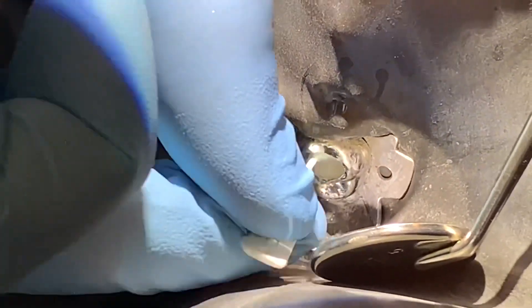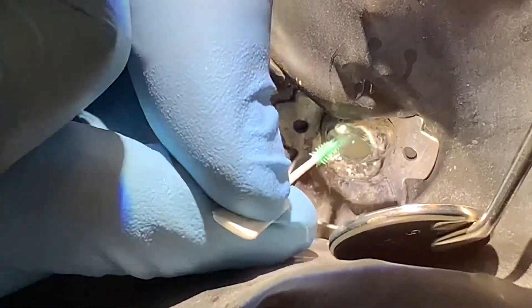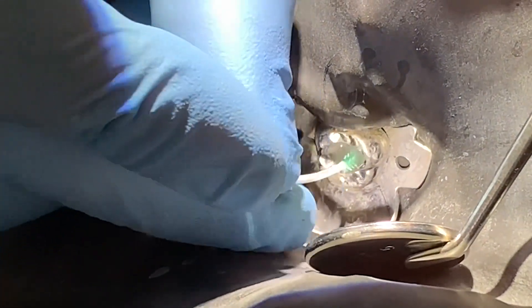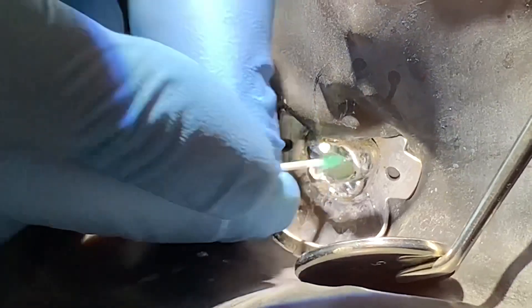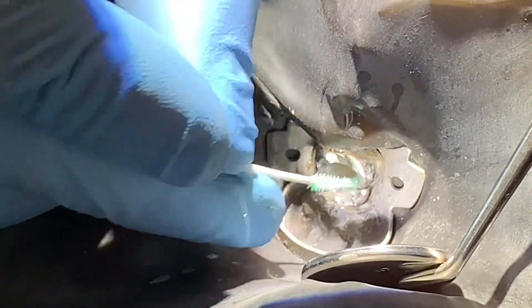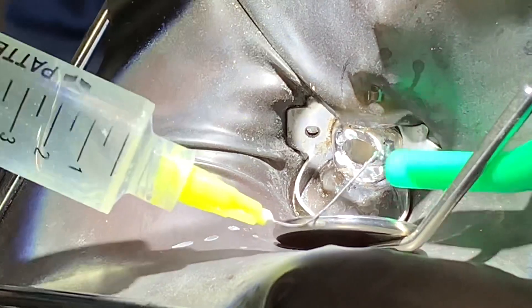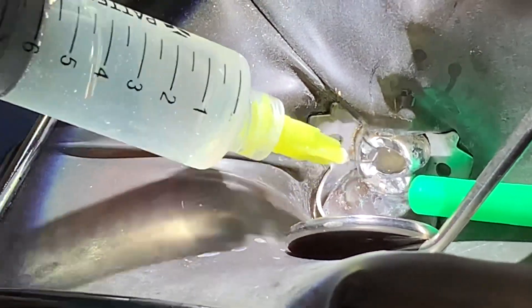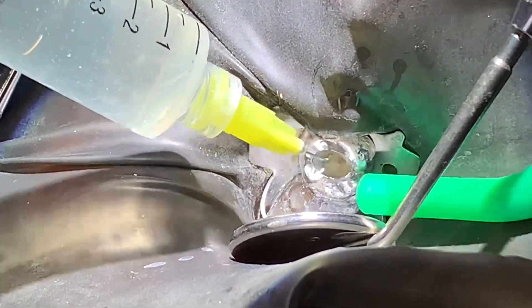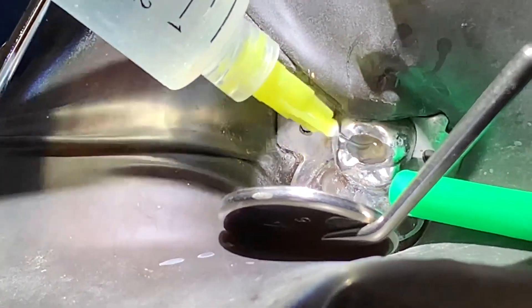I found a missed MB2 as well, so I'm just scraping and cleaning the canal walls with this. Then I'm going to go back in with my hypo — and look at all kinds of stuff coming out now. All the things that were stuck to the walls of the canals are all coming out.